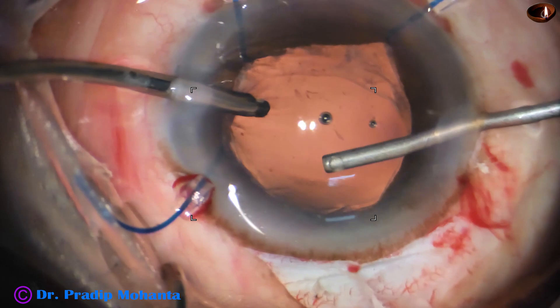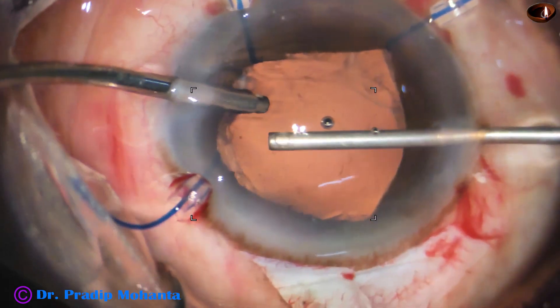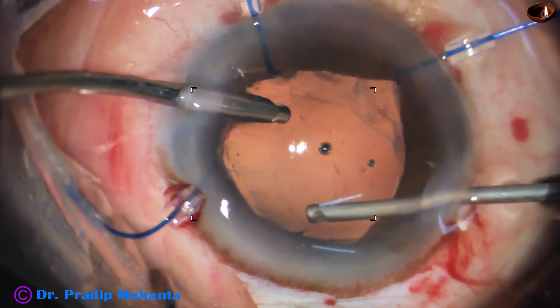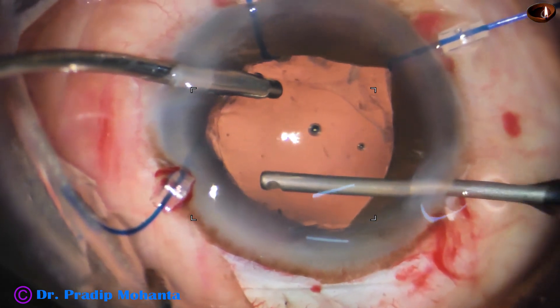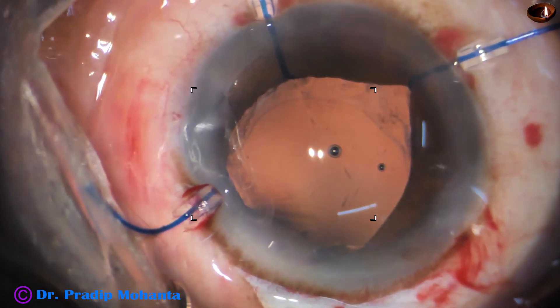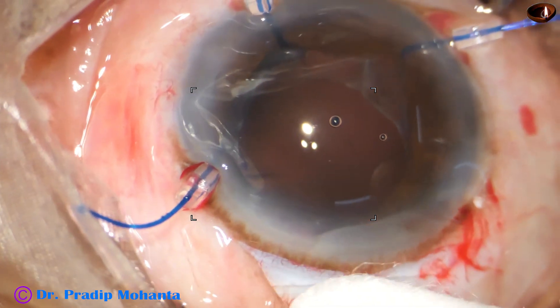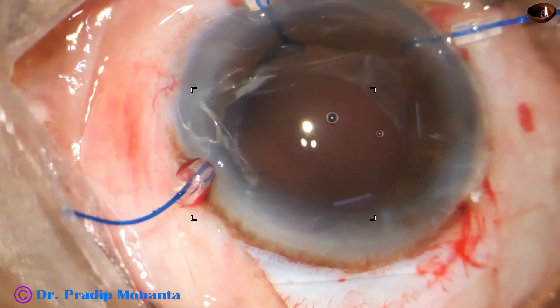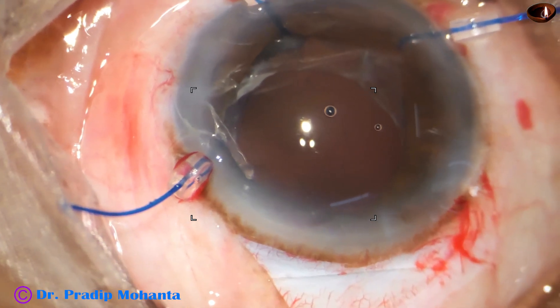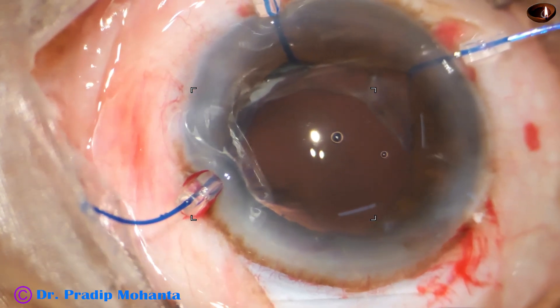No vitreous strand should prolapse into the anterior chamber or hook the pupillary border and come out through an incision — either the side port or the main wound. I am using enough time for vitrectomy with the cutter. This video took about 35 minutes and has been edited to about 20 minutes. I request you to observe the full video. I am planning to get the post-op pictures today and will attach them before posting the video.